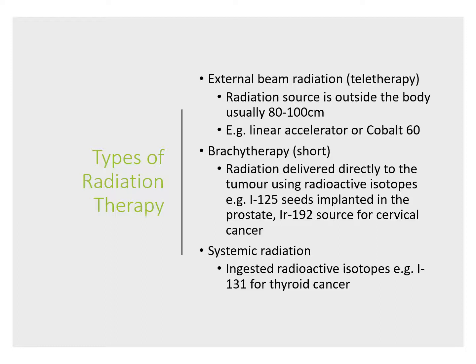Anyway, let's move on. There is also brachytherapy, where brachy means short, like bradycardia. It is giving radiation therapy by embedding small seeds into the organ that you want to treat. So, for instance, in prostate cancer, you embed small seeds into the prostate to give a constant dose of radiation. Now, there's a third type, which is ingested radiation, and in this type, someone takes the radiation isotope by mouth, and it works that way. This is used in treating thyroid cancer.